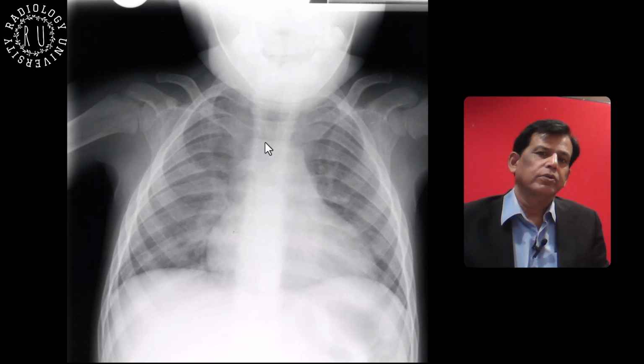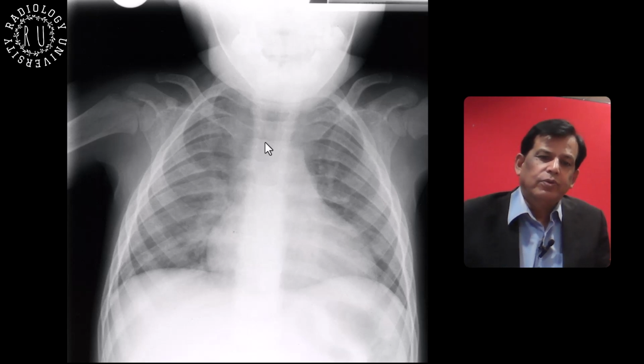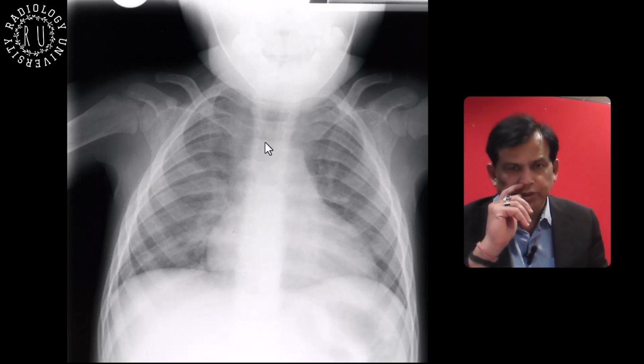Okay, good. So can you link things? Cardiomegaly with broadened, widened, flared ribs. What are you thinking? Is it something hemodynamic? Is it something diffuse? You saw AVN also. Any hemopoietic thing? That was what I was thinking, but I could not see any extramedullary hematopoiesis or any evidence of soft tissue masses in the paravertebral region. Okay. It could be thalassemia.